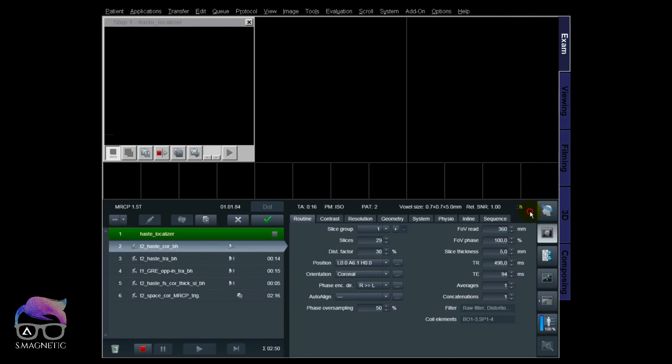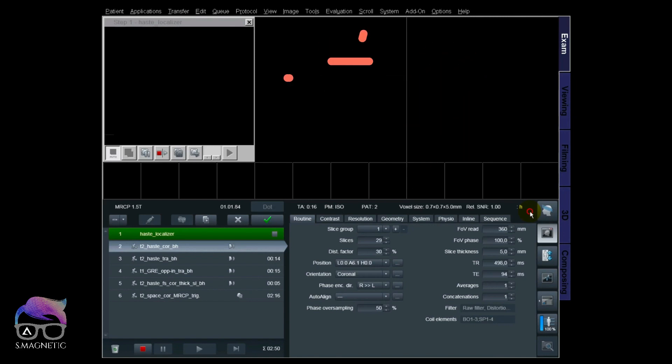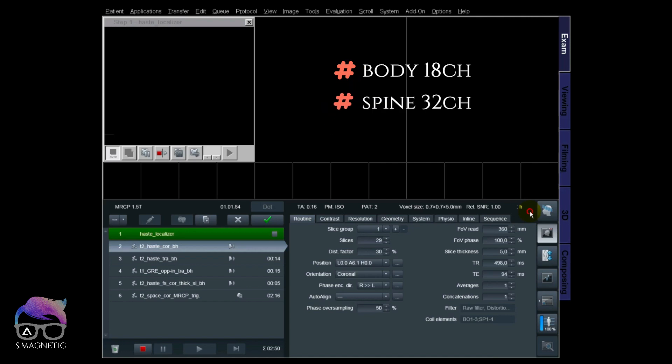Let's get started. We are currently at the 1.5 Tesla scanner. I'm using a body 18-channel coil combined with a 32-channel coil.